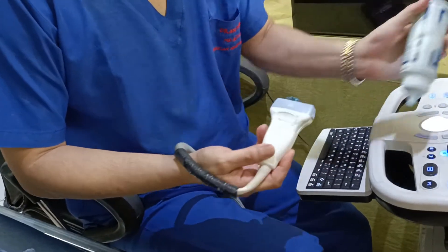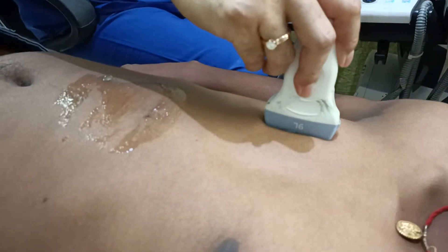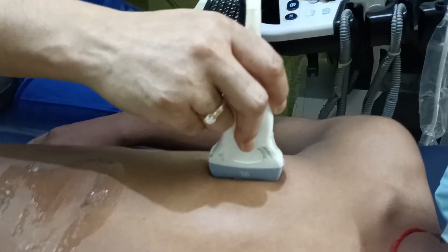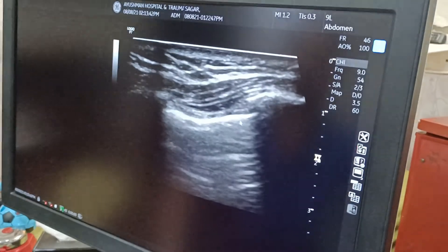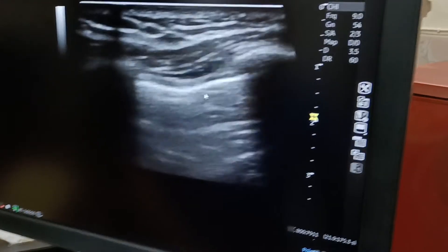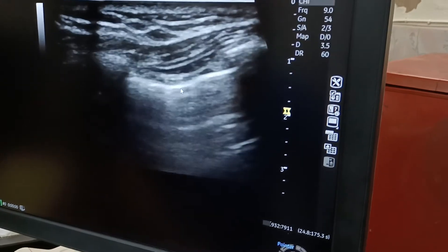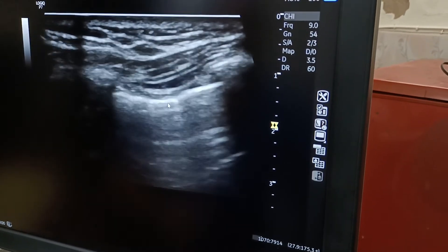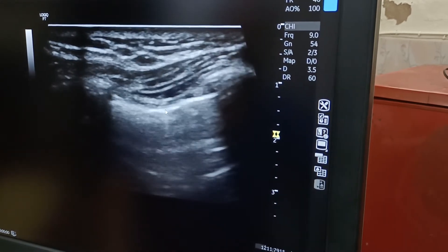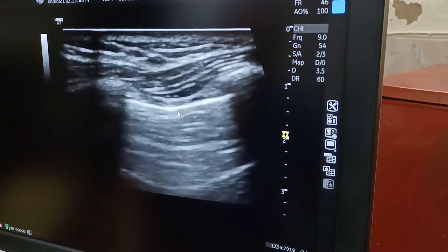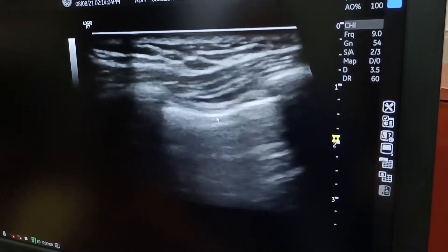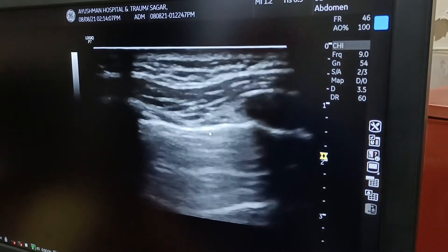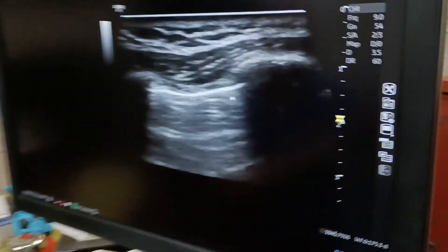Now you can see this white shimmering structure which is moving with respiration — that is the pleura. The movement of the pleura with respiration is known as lung sliding, and this will be absent in case of pneumothorax because the air will restrict the movement of the pleura. This is how you scan the chest as well, because pneumothorax and hemothorax are potentially life-threatening conditions, and you should be able to scan both the abdomen and the chest in case of trauma — either penetrating or blunt.